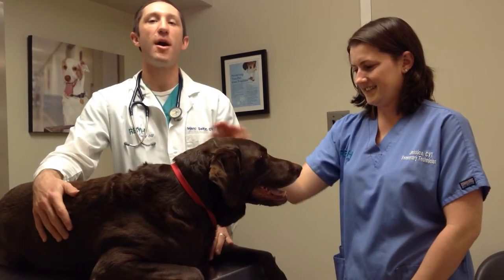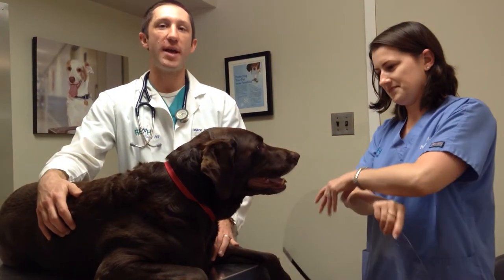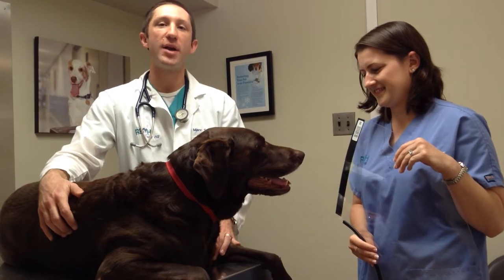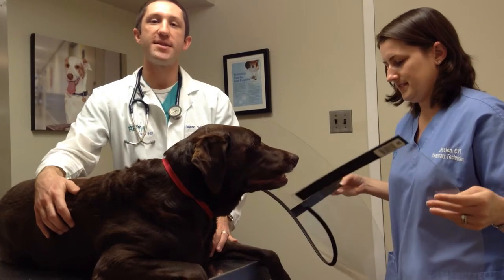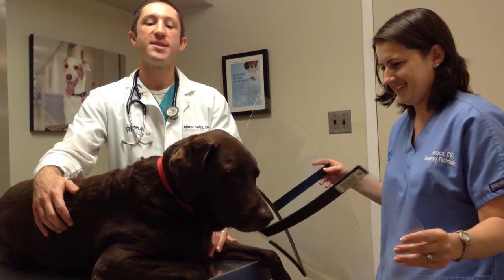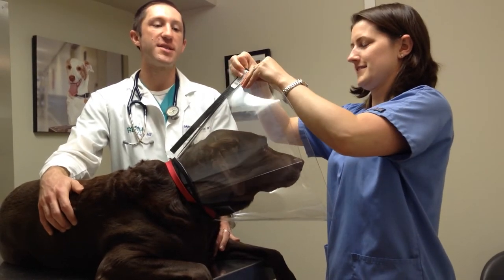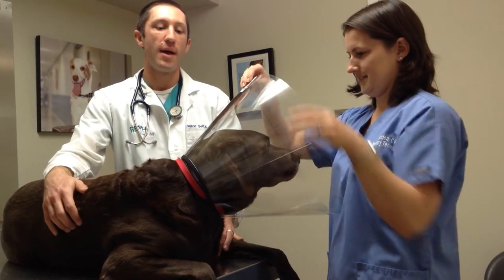We're going to discuss probably one of the most common and popular e-collars, and that's the plastic cone. There are numerous variations on the same design, but we'll start with one of the ones we carry here at our hospital. Jess is going to demonstrate how to put each e-collar on as I discuss it. To put a plastic cone on, you want to fit it such that it's tight enough that it can't be pulled off the head, but still loose enough that we can get two fingers in. Some use the dog's e-collar, others have straps. Ours actually has a velcro, so it makes it really easy. Jess pre-fitted this one and adjusted the velcro, and it fits on.